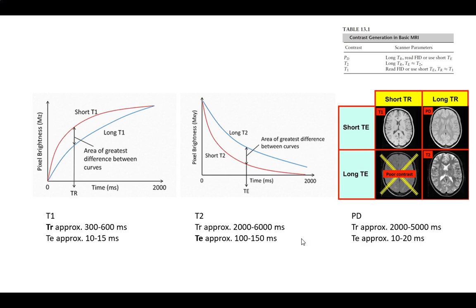With the protons, that's the only thing left causing any variation. The more protons you have, the stronger your signal. That's the proton weighting. So things without a lot of protons in them will be weak, and those with a lot of protons will be strong.